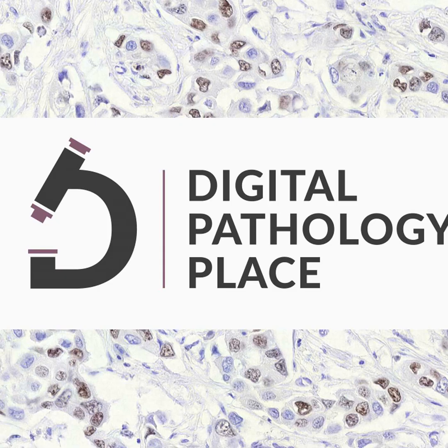So before I read your article, and I will link to it in the show notes, I knew about two approaches. The first approach was to train on not so similar images, so across different domains to account for those variabilities, or do the stain normalization with GANs, generative adversarial networks. But from your article, I learned that there are several more approaches that can help us. And I thought with those two, I was already very on top of the matter. Apparently not. So how many solutions do we have, and what are the ways to increase the robustness to domain shift of histopathology models?